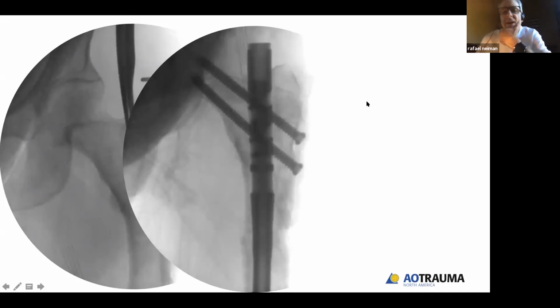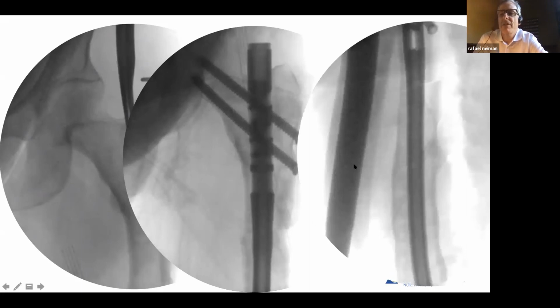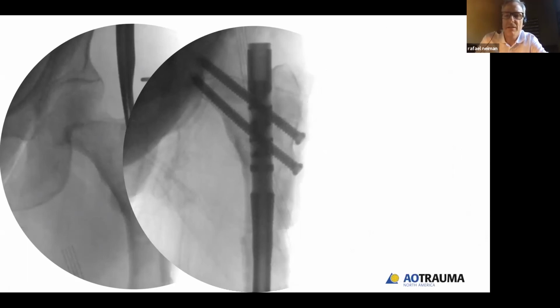I don't have the saved pictures of doing the osteotomy. We have a correction. Is it a good enough correction? What else is in here is just supplementing the bone at the top, using a resorbable cement to fill in that defect. I'm not sure it was absolutely necessary, but at the time I felt like I wanted her to have a little bit extra support in some way for the top of the nail and that screw.